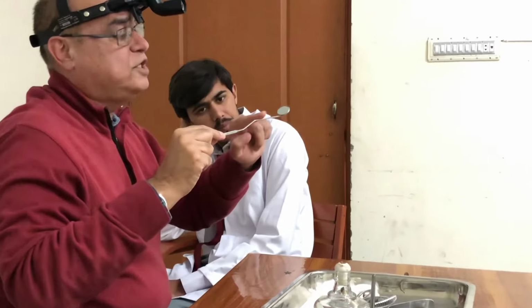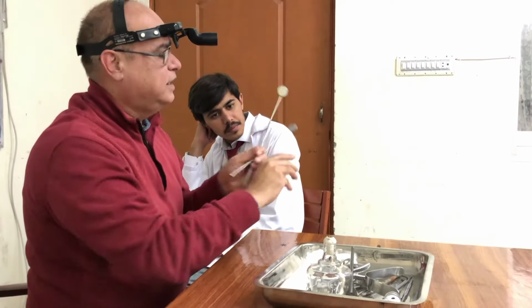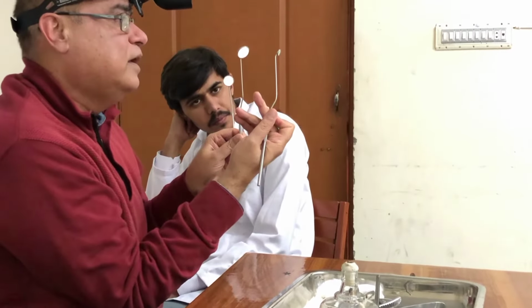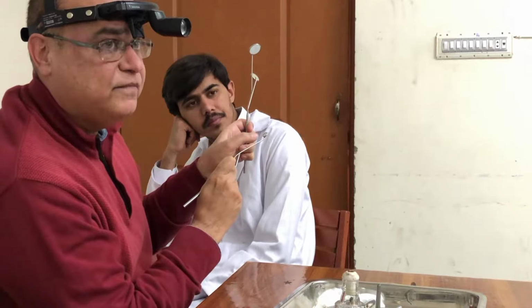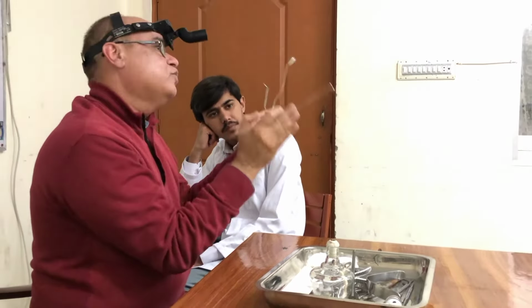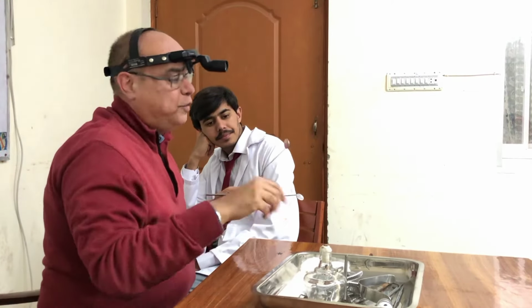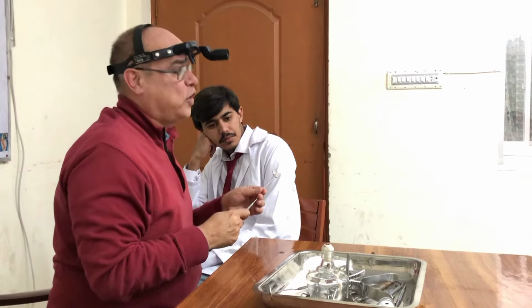By the way, this is called the posterior rhinoscopy mirror, the mirror with the limb, and you can see the size of the mirror is different, even in children. You can very well imagine how much you would be able to look far into the mirror. That's what I am reiterating, that it used to be very difficult. But still, according to the size of the oral cavity and oropharynx, you have to use this. So you will warm it so that it is not fogged.